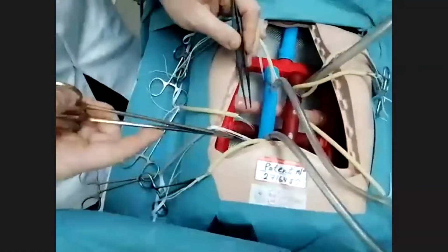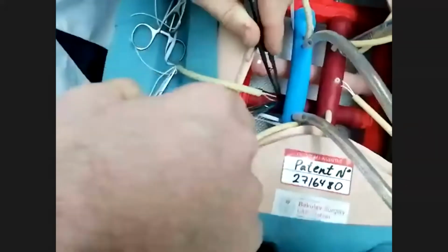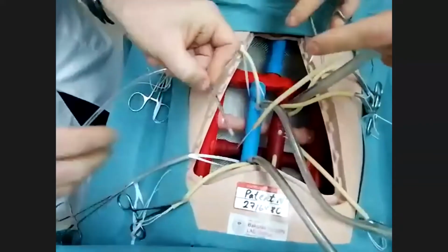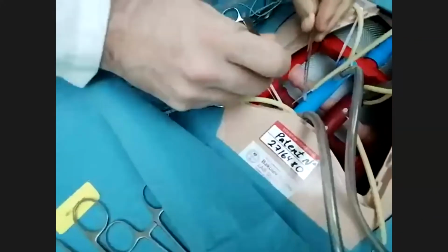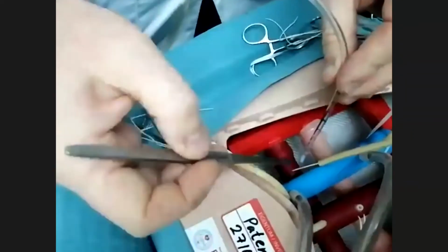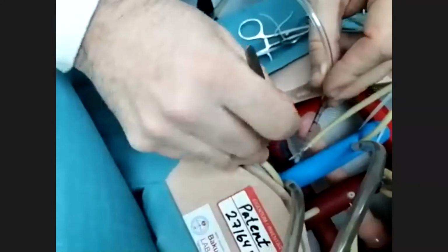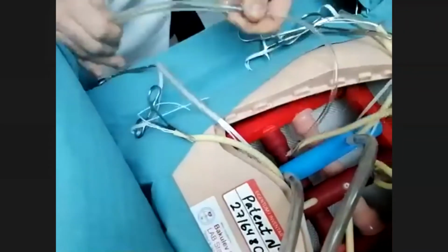Then the next step is cannulating the left heart through the left pulmonary vein. 4 purse-string. This is a catheter for the left heart. It's very important to put it into the left heart without air. And I ask my anesthesiologist, give me a big breath, a deep breath. Okay. Left vent on. Okay.